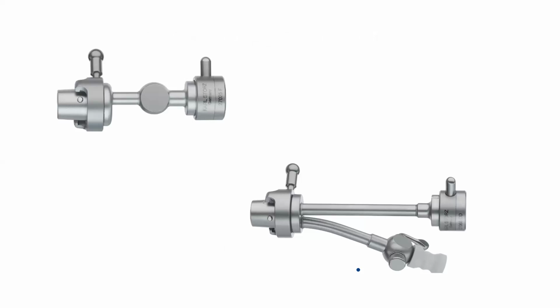Why are there two bridges? Are both these bridges the same? No, sir. What is the difference? There is no instrument channel in the first one, only a telescope channel, while the other one can admit instruments, sir.